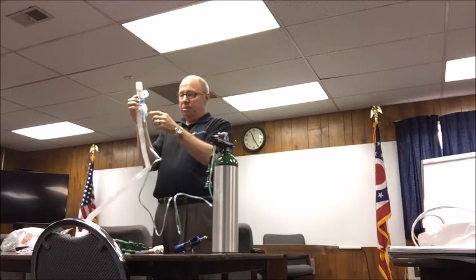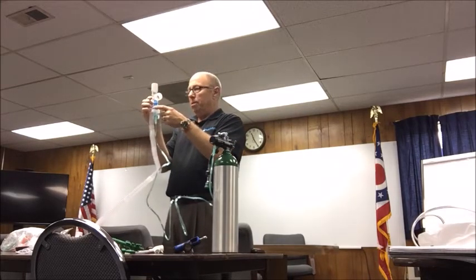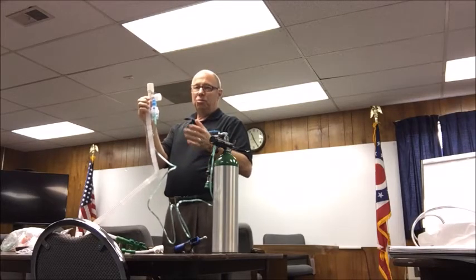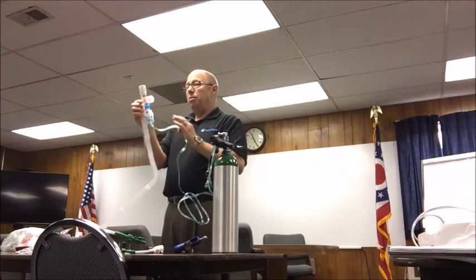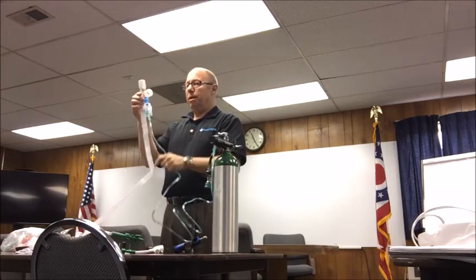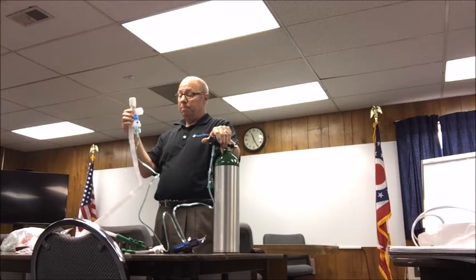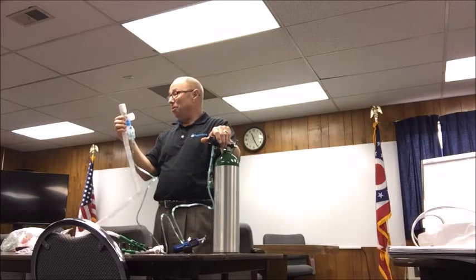Now, this nebulizer has a needleless port. So if I want to give a second treatment, I can take my albuterol pillow and stick it right through here and give a second treatment. That sounds real good in a hospital where they're not moving. But in the back of an ambulance, this is what's going to happen. All you have to do is kink the hose, pull this out, drop your medication in, put it back in. That's how simple it is. And now I'm nebulizing the patient. Nothing's changed.